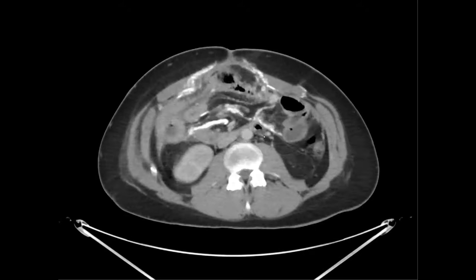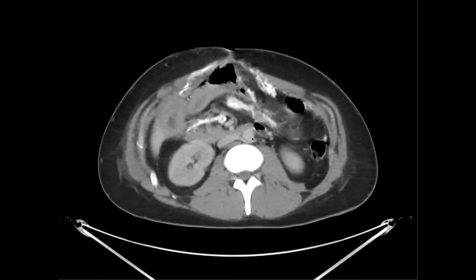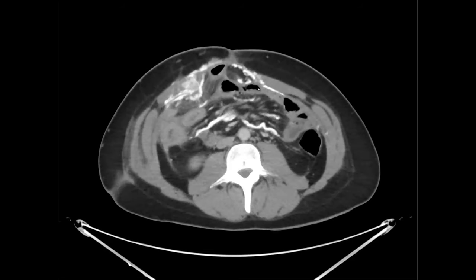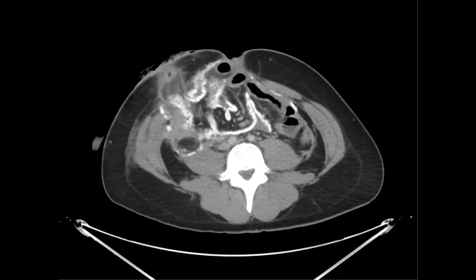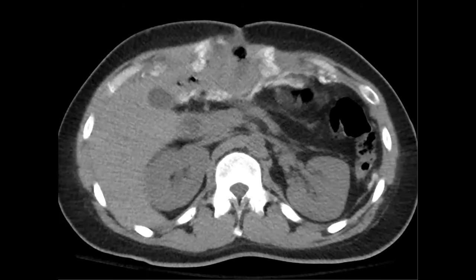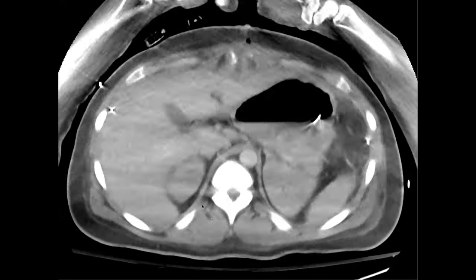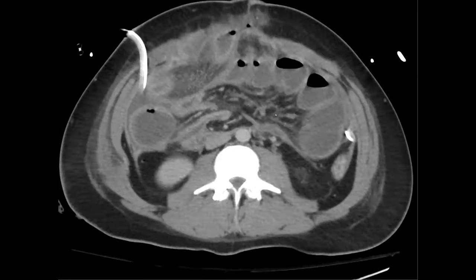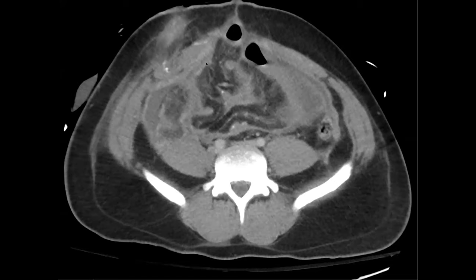When I saw this, I was thinking maybe there was extravasated barium, like maybe the patient had a bowel perforation and some contrast had been extravasated. But they did not have a bowel perforation and they did not get oral contrast. The interesting thing was that a couple of weeks prior, they had also gotten an exam, and you can see there's none of that calcification, but maybe a faint amount of it is starting here.